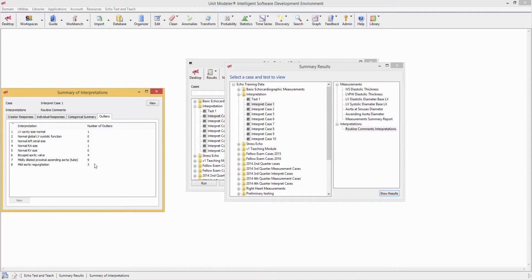The simulation is based on the concept that you will remember that which you got wrong longer than that which you got right, and our trainees learn a great deal from this type of examination, where they have the option of knowing they're wrong, and they know that I can see that they're wrong because it's in the records, and they can compare and know that they weren't as good as their peers.